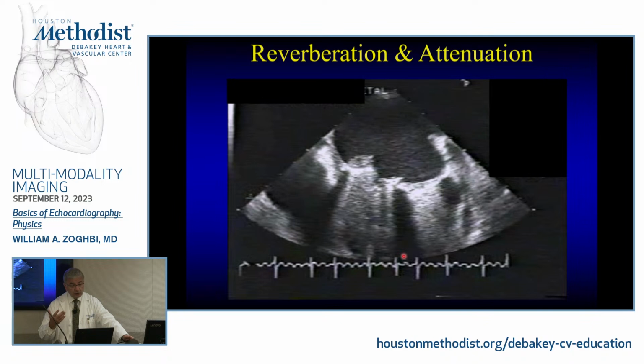Now, I could have issues with it. One is the reverberations. This is what you see here. This is a mechanical valve with a lot of reverberations behind it. This is the thrombus on a mechanical valve.